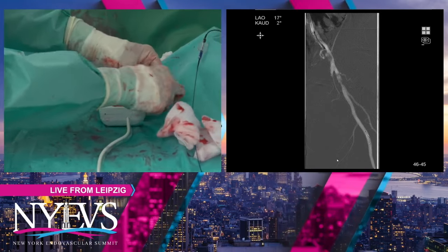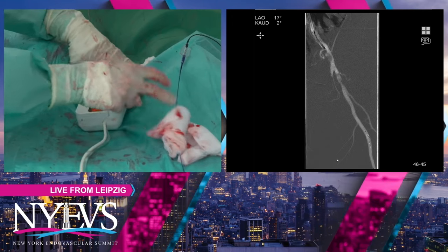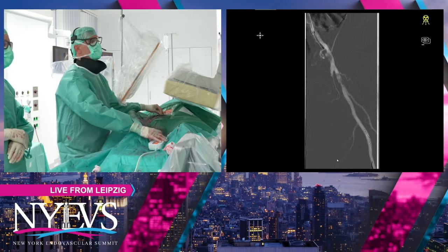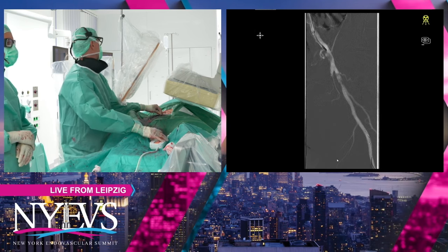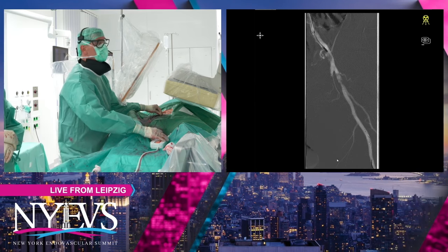very high comorbidities that are preventing it, body habitus, this is probably something that I would approach from an open procedure. When you see this kind of lesion in person, it's going to be a really large, exophytic, highly calcified disease, really going to respond well and have some pretty nice long-term durability.